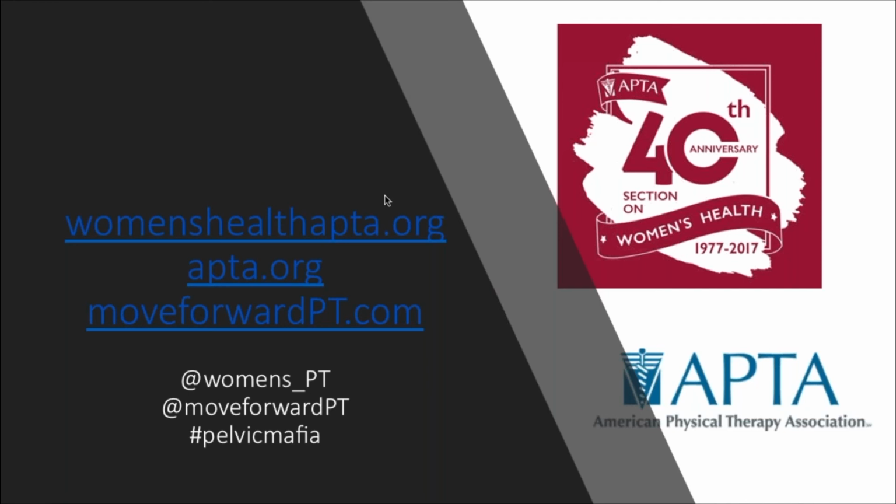Are there limitations for ultrasound assessment of the pelvic floor muscles? For example, large body habitus or a massively large prostate in males? I would say, especially with the transabdominal approach in women, a lot of the issues I run into may be a larger patient, but also if they have had a lot of abdominal surgeries.